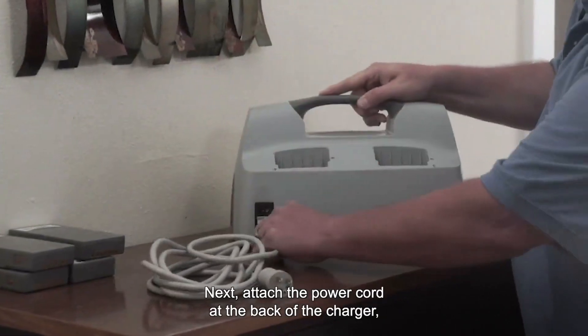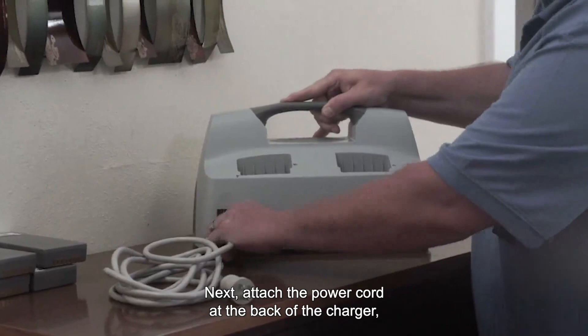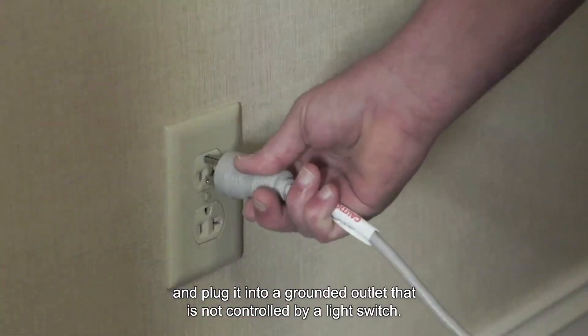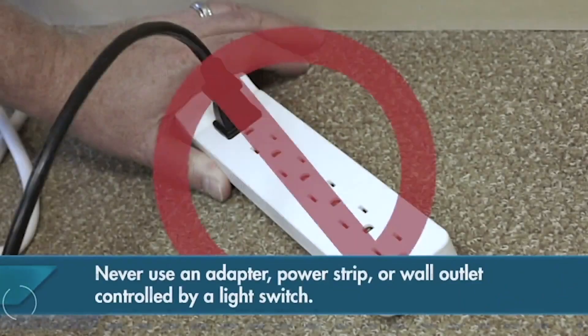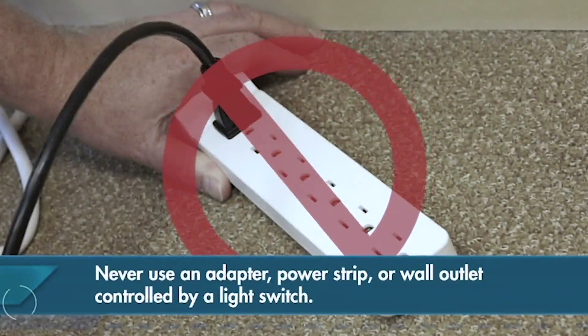Next, attach the power cord at the back of the charger and plug it into a grounded outlet that is not controlled by a light switch. Never use an adapter or power strip.